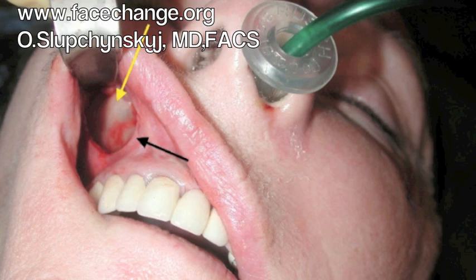In this second intraoperative photo, we see that an incision is made under the lip in a subperiosteal plane connecting the temporal incision. The yellow arrow shows the subperiosteum or the maxillary bone, and the black arrow shows the incision. This will connect to the temporal portion of the incision.